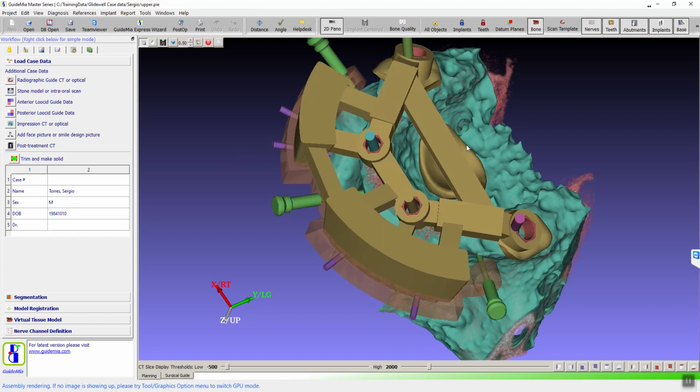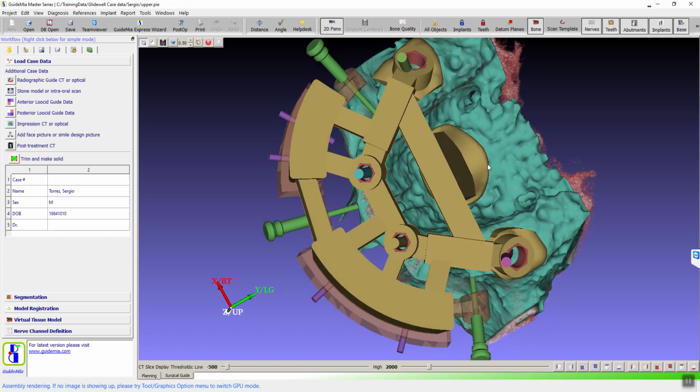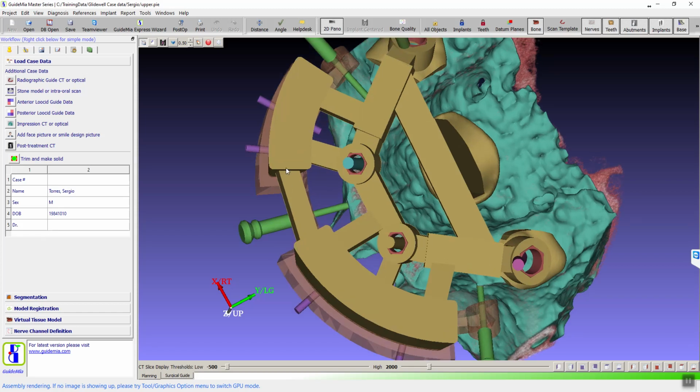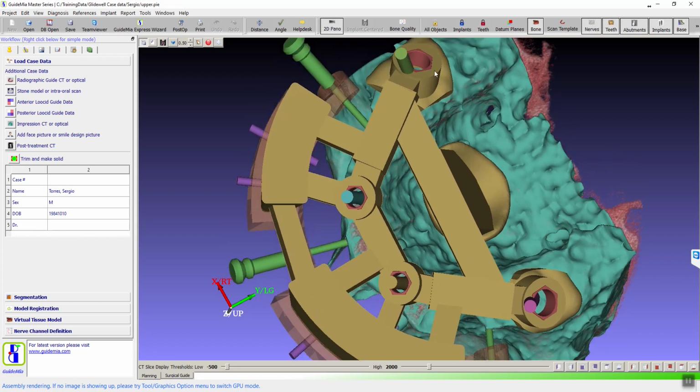We put on the surgical guide. You see here, the major thing is the positioning. We're going to change this one a little too. So we sit on the bone reduction guide because this is thicker. We can expect better accuracy on the lingual part, on the lingual side. This is done per a doctor's request. He wants to partially sit the guide onto the soft tissue, but eventually we're going to change that.